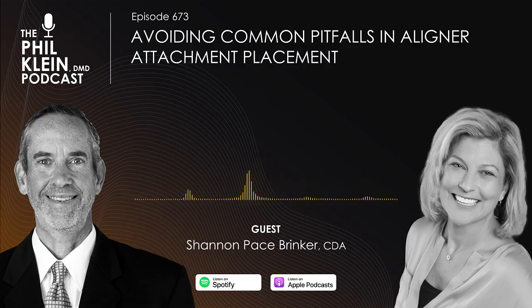So one of the things that I love is I like to place Cervitec F. They've got all different ones, but Cervitec F was the first one that came out. Now they've got so many things coming out. They've got Cervitec Plus, which is basically chlorhexidine. It's going to clean that area really well, and it's going to protect it. Every time we do attachment placement on a patient, we use Cervitec to go around and clean up each attachment again. It's almost like a Band-Aid on there, but it's going to protect it and hopefully keep that biofilm from it.